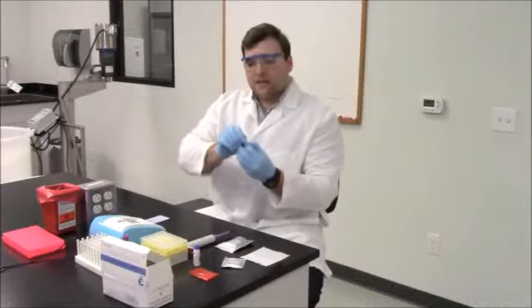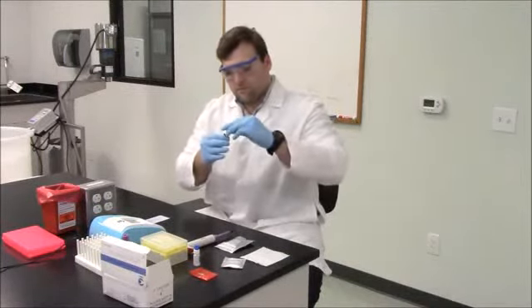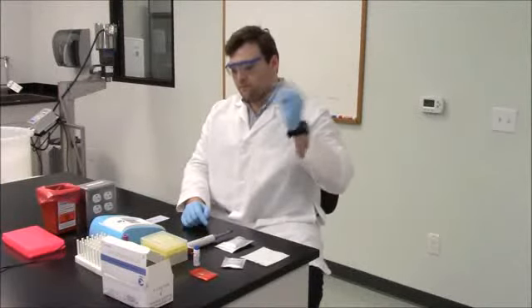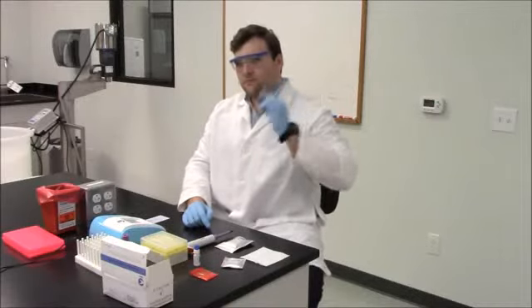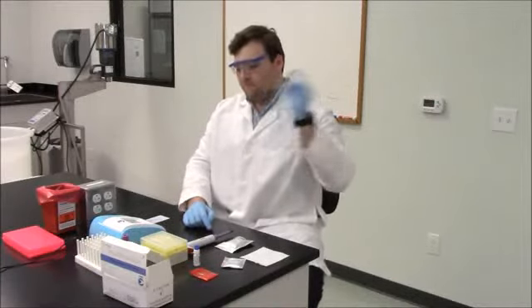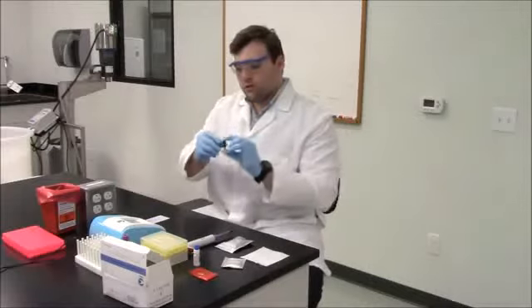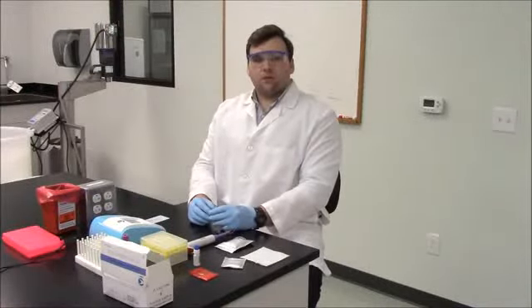Next, add the capillary to reagent R1. Add blood sample to R1 reagent. Make sure that the capillary tube is completely filled and wipe away the excess blood. Mix well by inverting for 10 seconds. Start incubation. Afterwards, the reagent tube is left to incubate for 2 minutes.